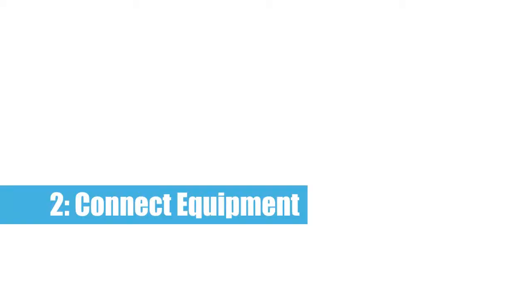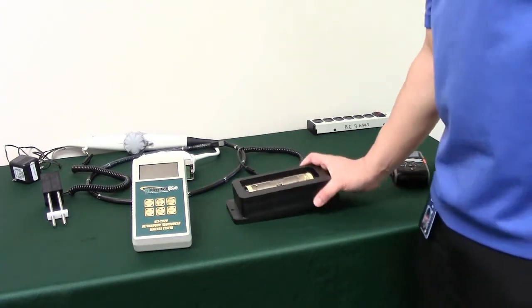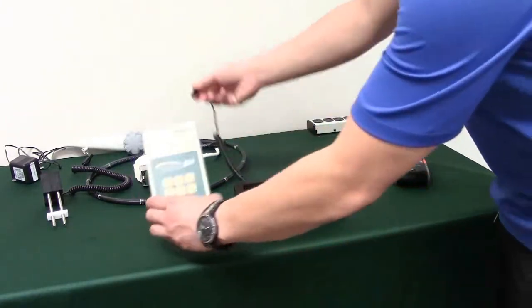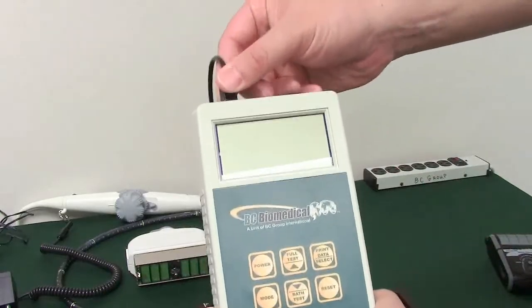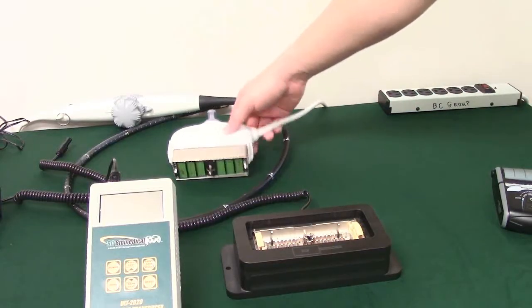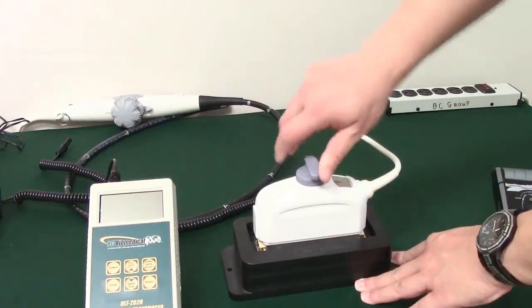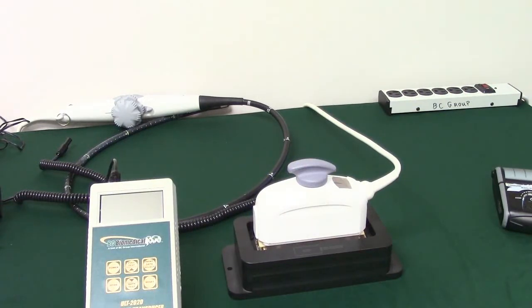Step 2: Connect equipment. Start by plugging your transducer adapter into one of the two ports on the top of the ULT 2020. You can use either port. Next, plug the ultrasound transducer into the adapter. The adapter should click into place. Look in your ultrasound transducer manual for OEM recommendations on connecting your transducer.